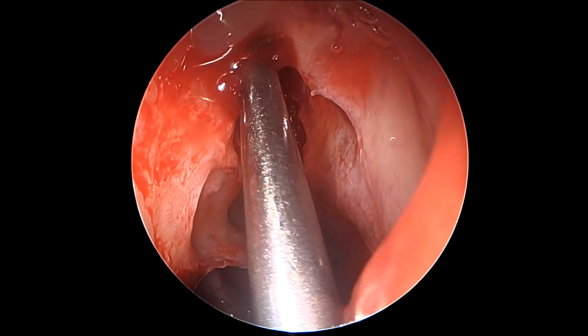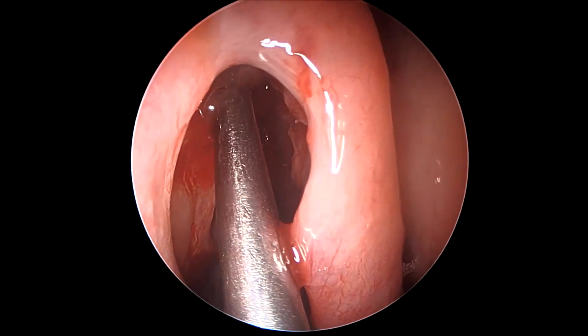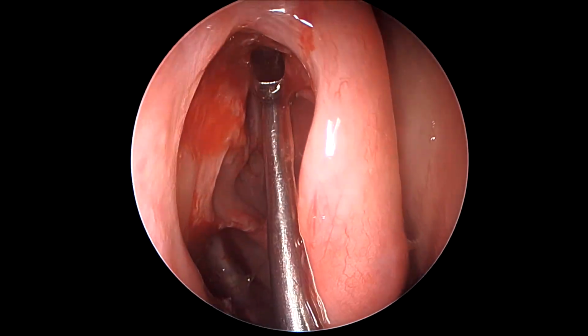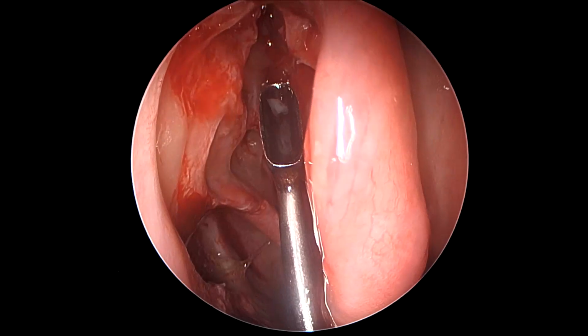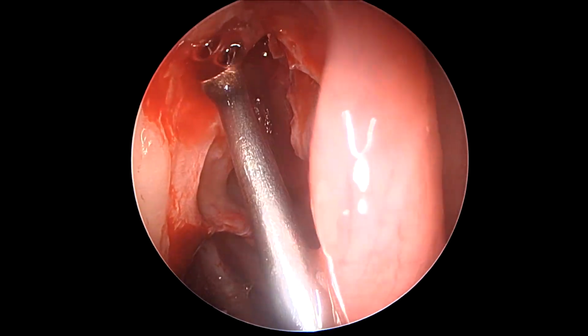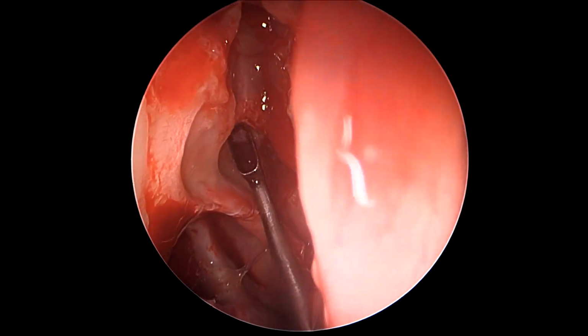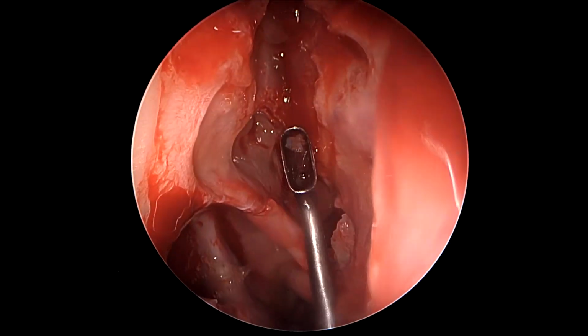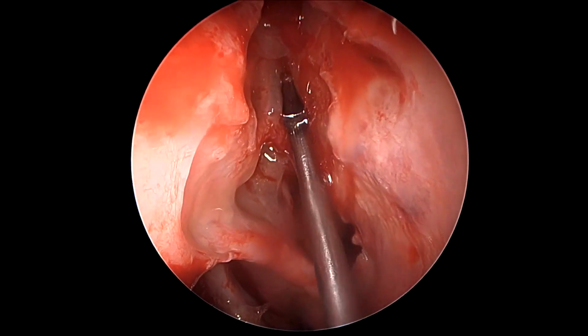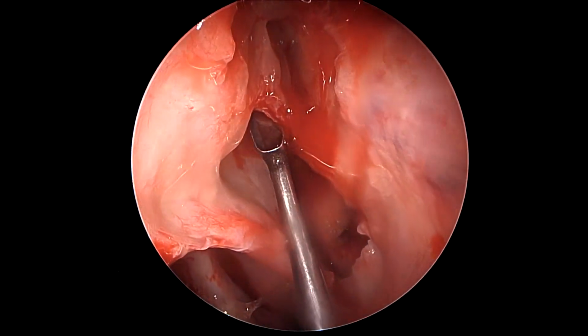So to summarize, the most important parts that we had to do as a revision in this kind of patient were basically opening the sphenoid widely again, removing the ethmoidal septations to reduce the chance of recurrence, and opening the frontal sinuses on both sides widely by removing all the cells that were causing restriction or crowding of the frontal sinus drainage outflow.